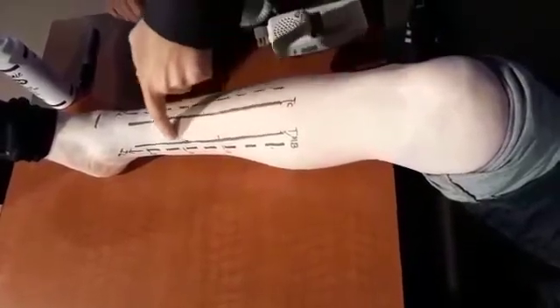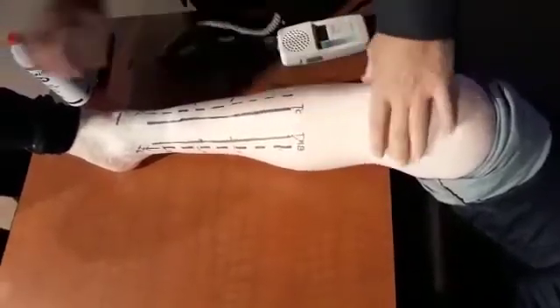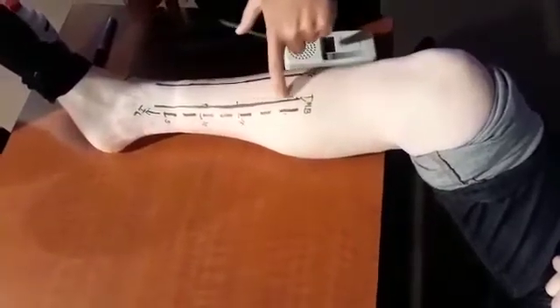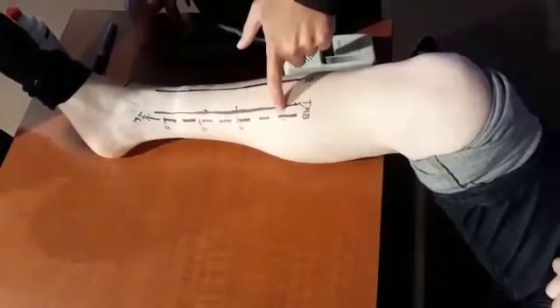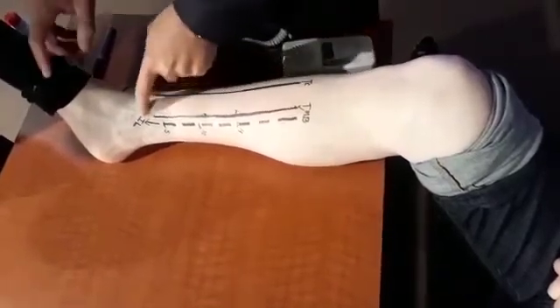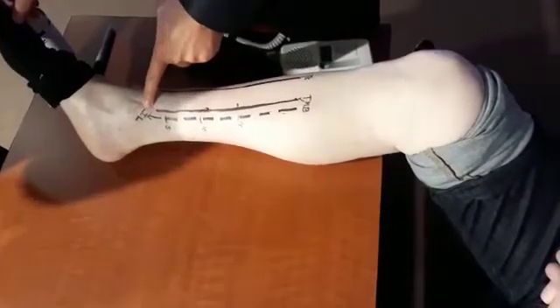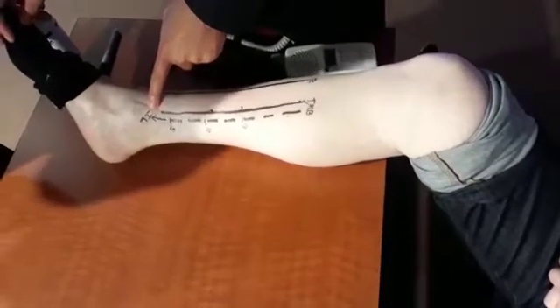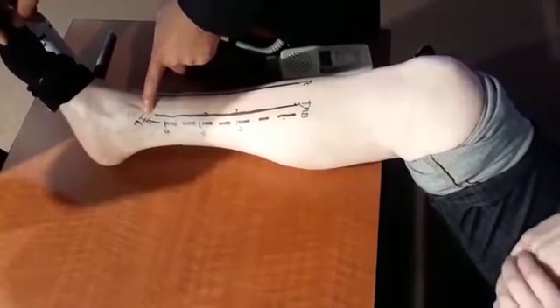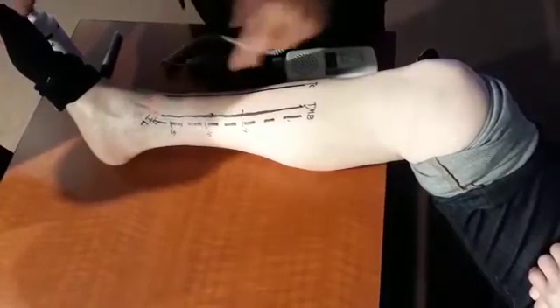This full line is the medial border of the tibia. The dotted line is one centimeter just inferior to the border of the tibia. If you look distally, it says incision line — that will be your incision line to a compartment fasciotomy of the posterior compartment of the leg, or if you have to do any kind of medial distal tibia osseous reconstruction.